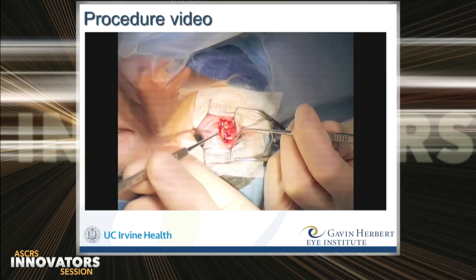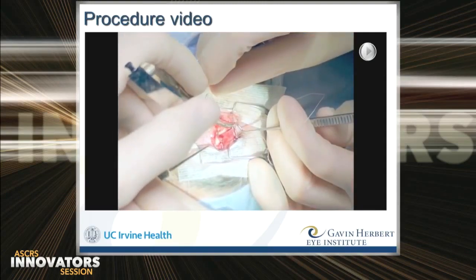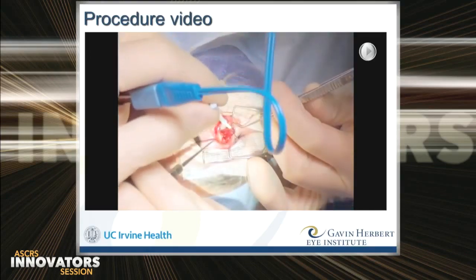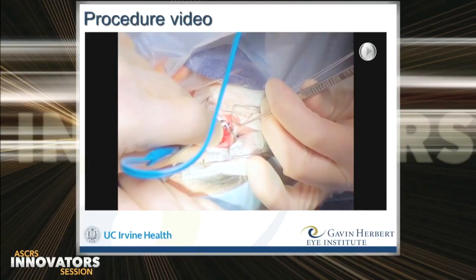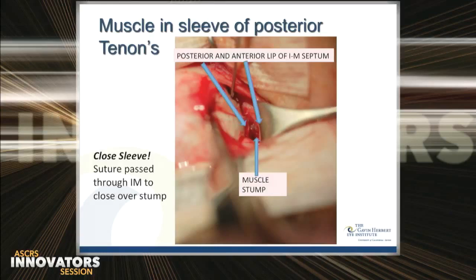In the following short video, you see that the myectomy resembles a large resection. We're using a 5-O-Mersalene placed at the desired point of excision. The muscle is clamped and then serially cauterized with adapted right-angle instrumentation to control for hemostasis, and then the anterior section of the muscle is removed. After removal, the stump of the muscle is seen in the intramuscular sleeve, and the Mersalene suture or a new suture can be used to sew the two lips of the sleeve shut to prevent anterior migration and reattachment to the globe.